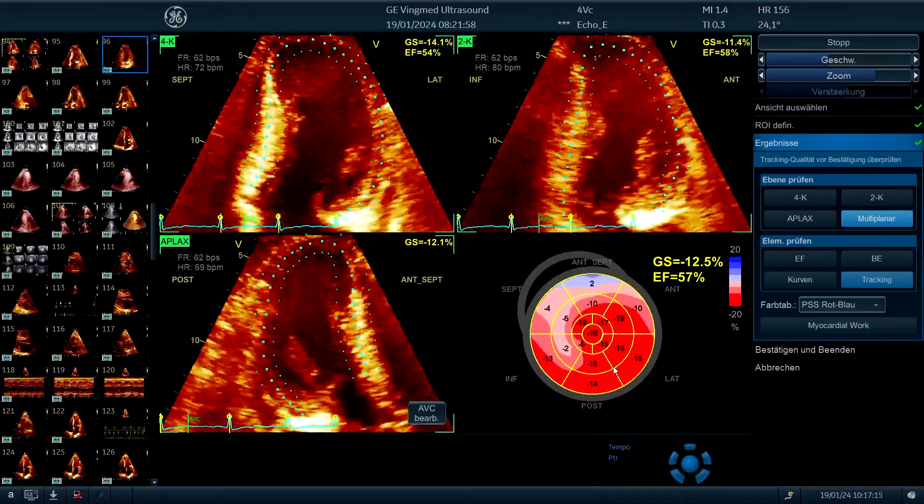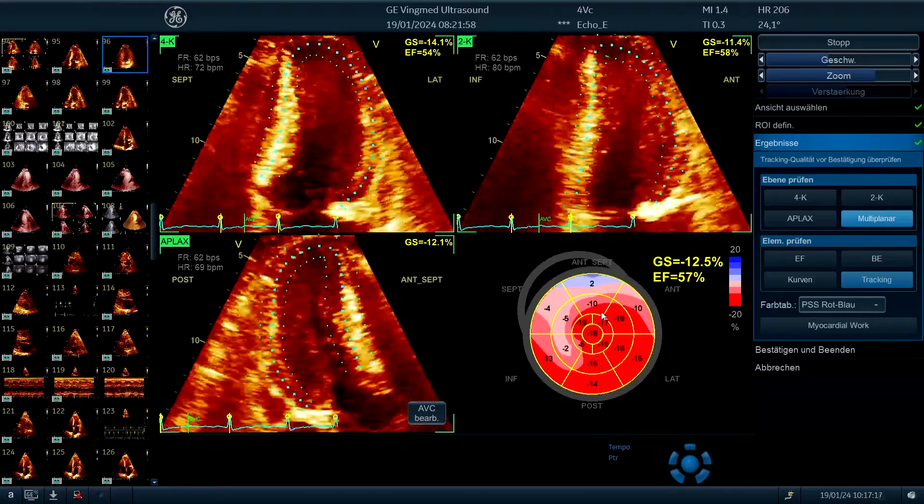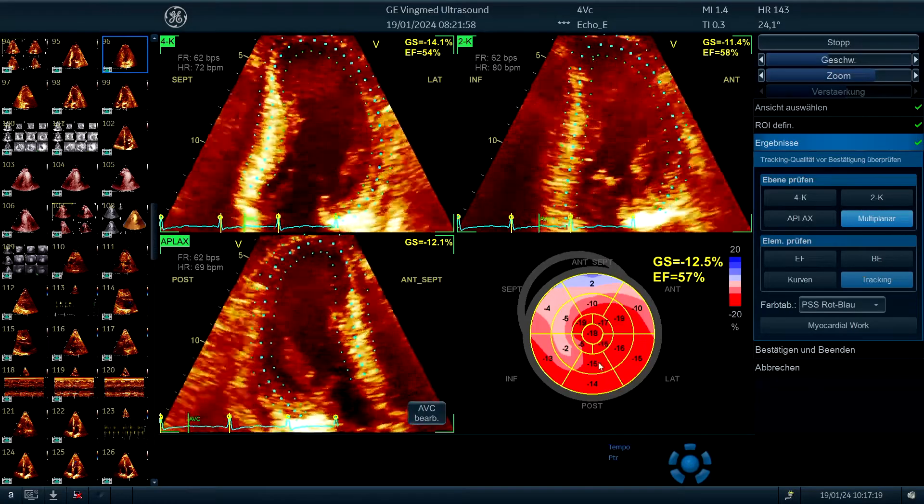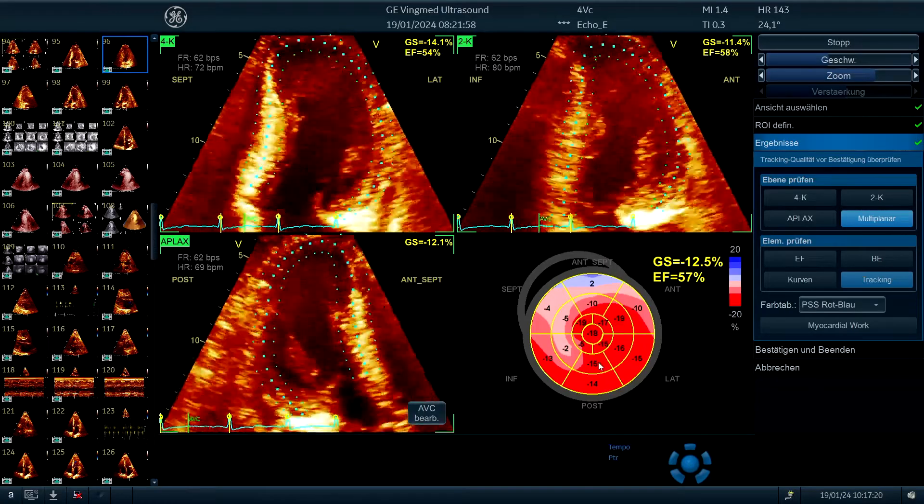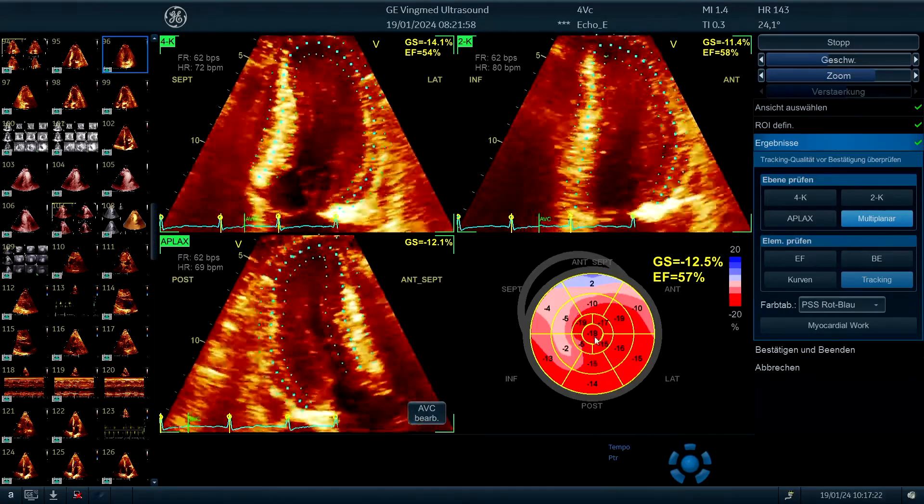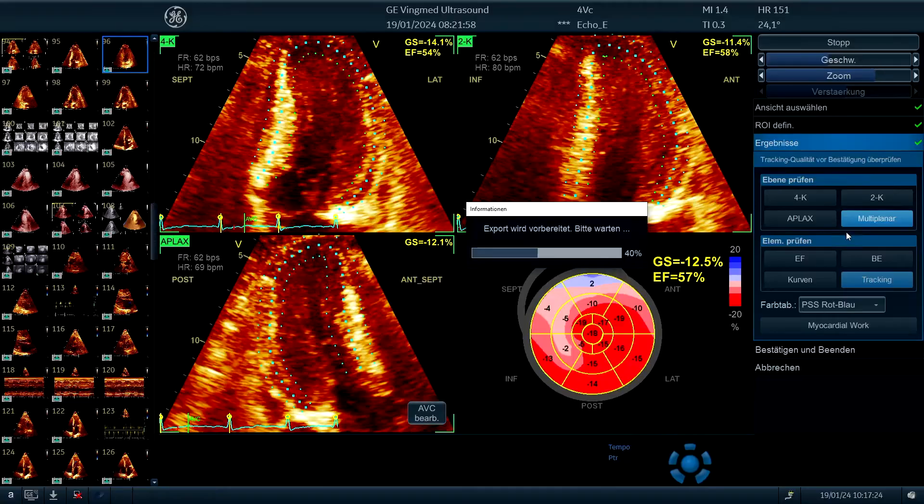So that's a typical feature of hypertrophic cardiomyopathy and you see also a basal to apical gradient. It's not typical for amyloid heart disease, for example, but it's definitely pathological and worth to notice.